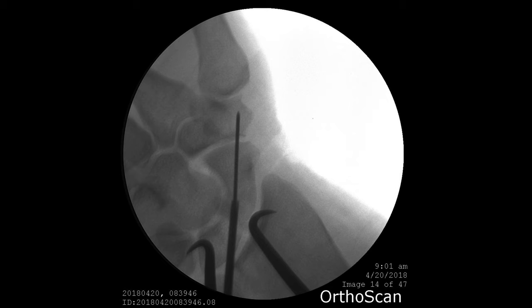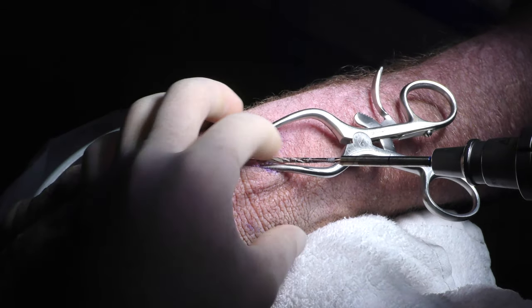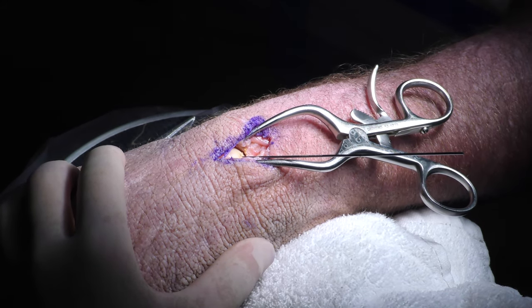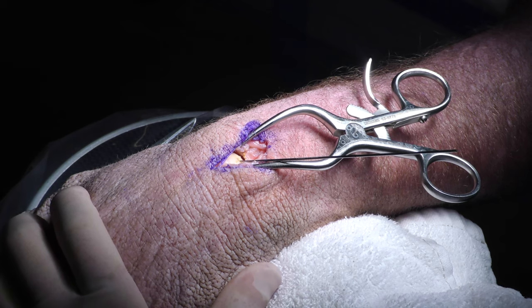Should be good there. A lot of times I'll pulse the drill and pull it out, and I'll take a picture to make sure I'm not pulling the wire out. Then at this point, you can have your assistant grab that wire with a hemostat. We didn't need to, we were fortunate. And now you're ready to put the screw in.